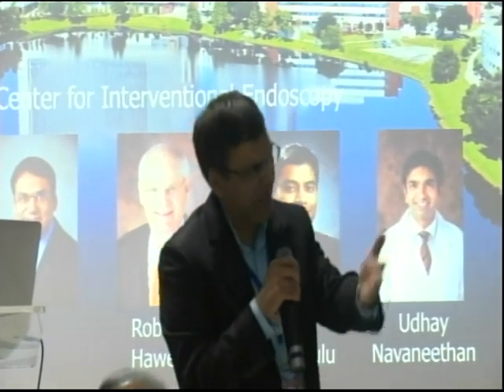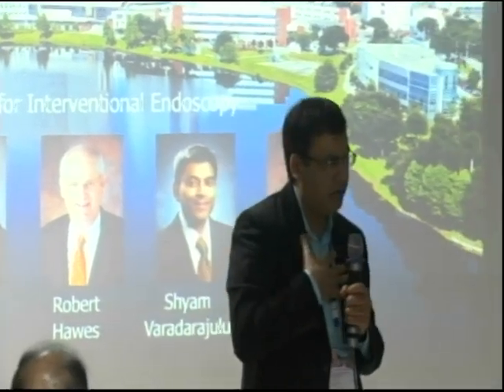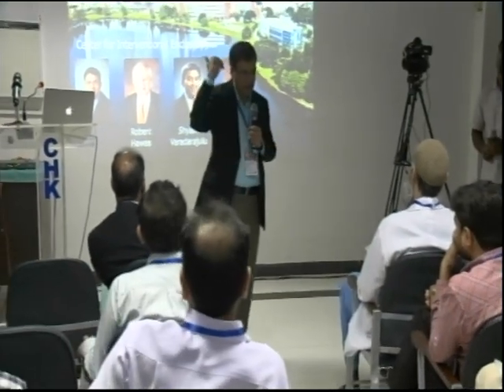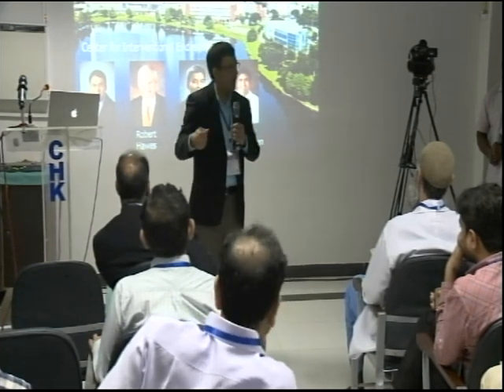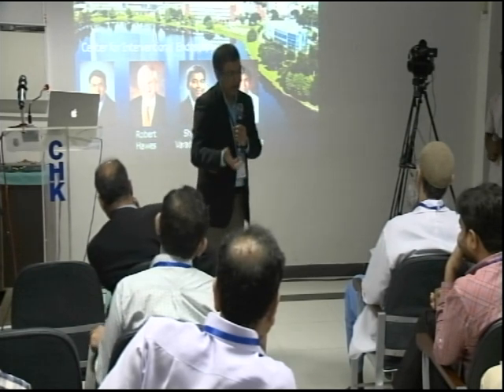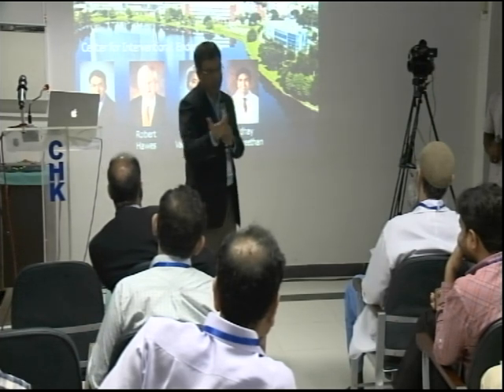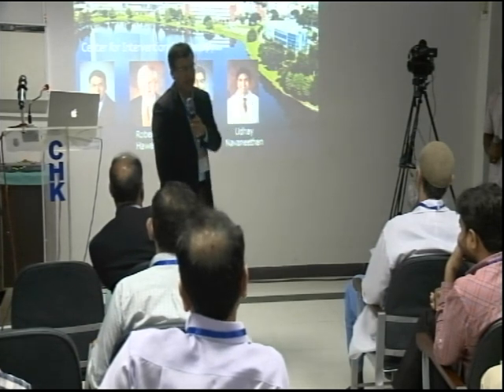So it really depends. Keep in mind that you have to keep your body comfortable, the patient has to be comfortable, and the scope has to be comfortable. There should not be torquing on anybody there. So gentle movement, body movement, shoulder movement, wrist movement, keeping in mind that you don't stress any of those 3 subjects: the patient, the scope, and yourself. You have to do this all your life, so you can't be bending backwards and putting a strain on your back.